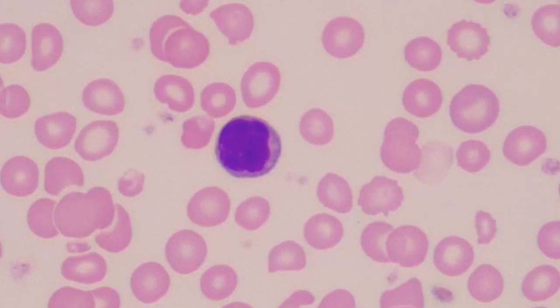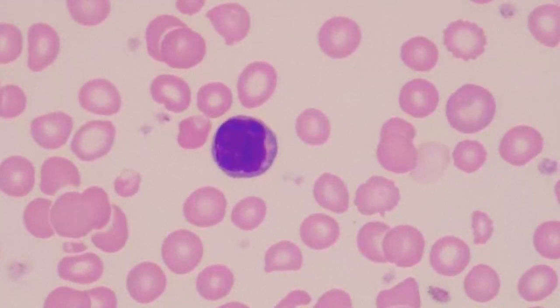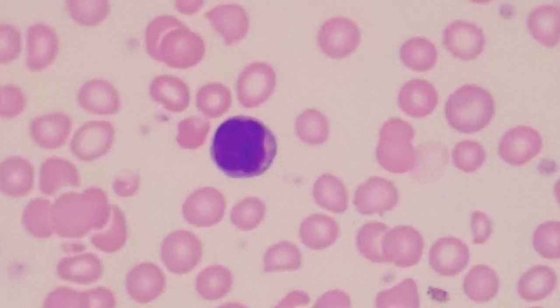So on this particular patient, we see that the MCV is 72, so below normal. So I would expect to see microcytic red cells, or red cells that are smaller than normal. So you can do a red cell assessment on 40x high dry objective lens. I've gone up to oil 100x just so we have a little clearer picture, closer look at what I want you to see.